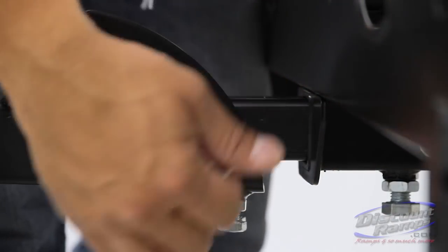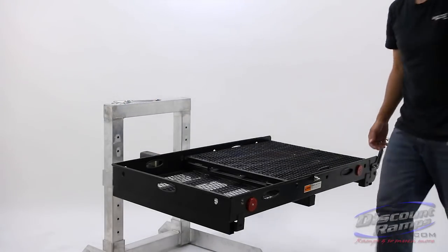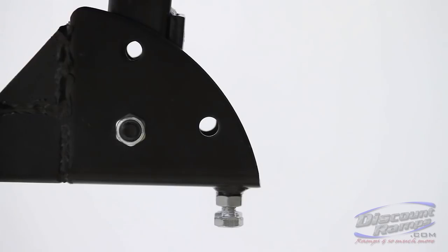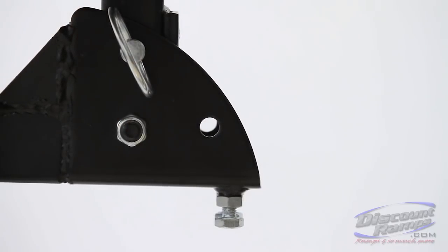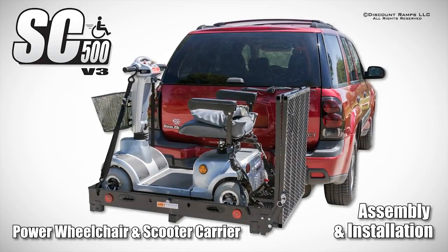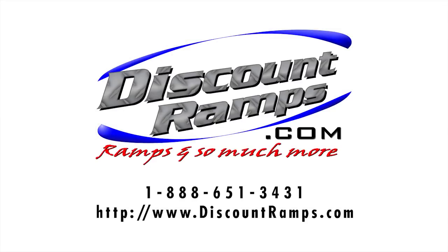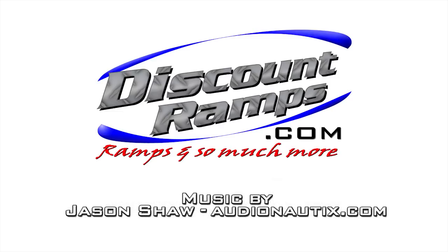Now remove the pole pin to fold the carrier upright. Replace the pole pin in the top hole to secure the carrier in the vertical position. Replace the pole pin.